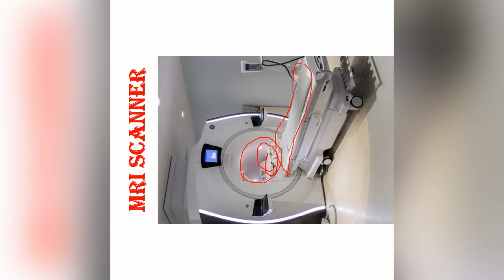Anyone having any sort of ferrous material in their body, for example, any pacemaker, cochlear implants, or vascular aneurysm implants, is advised not to go inside this room because it has a lot of magnetic strength, and it tends to pull everything that comes into the magnetic field, so it can lead to serious injuries to the people who are there.